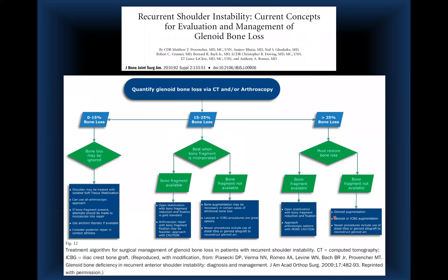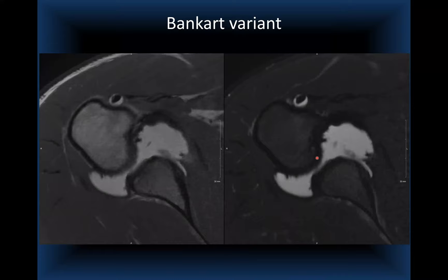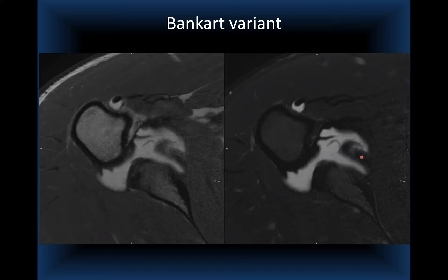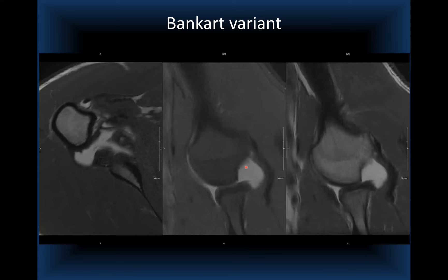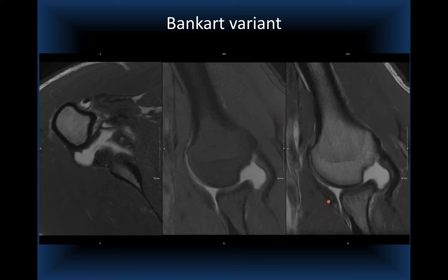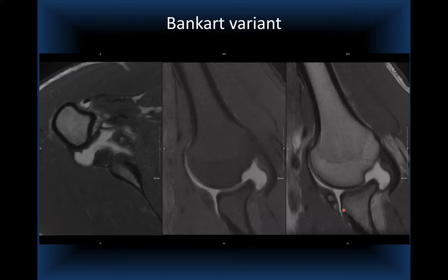Another Bankart variant shows a large mass of displaced tissue with bone fragments entering anteromedially. On ABER with and without fat-sat on the MR arthrogram, the complete detached anteroinferior capsulolabral ligamentous complex with bone pieces from the associated bony Bankart is clearly seen.